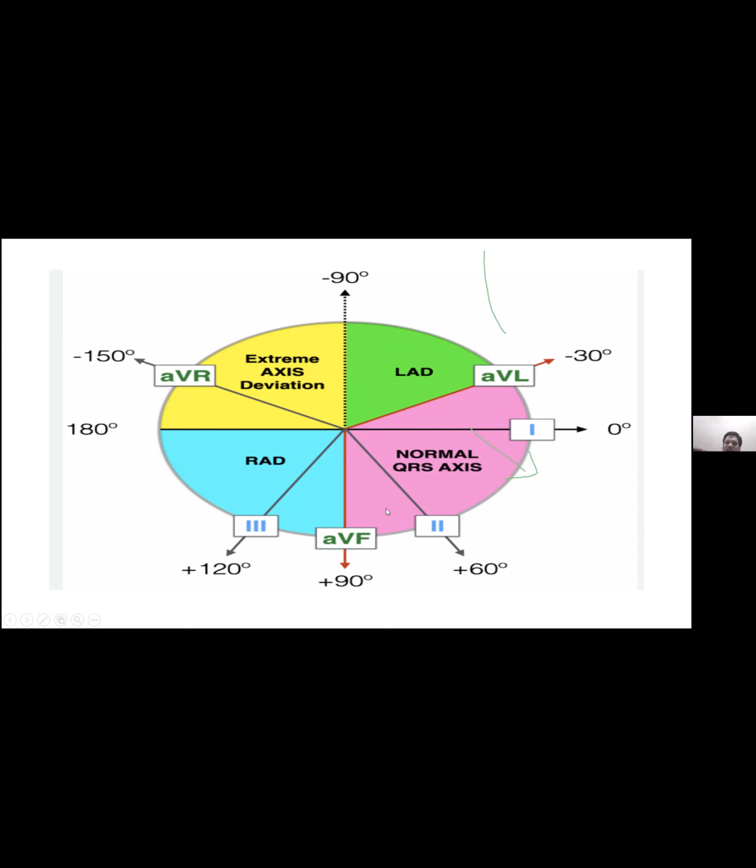And if you are going to take the ECG, you will need to know why I am talking about correlating with the ECG and the electrical leads. Now imagine I am standing with my arms stretched outwards like this. When I stretch out the arms like this, the left upper limb is called AVL, the right upper limb is called AVR, and the lower limb is called AVF. Right? So this again carries a message.